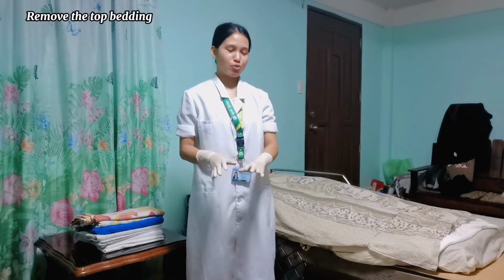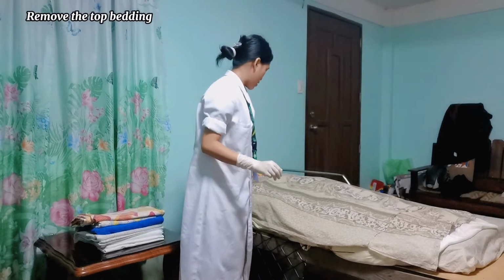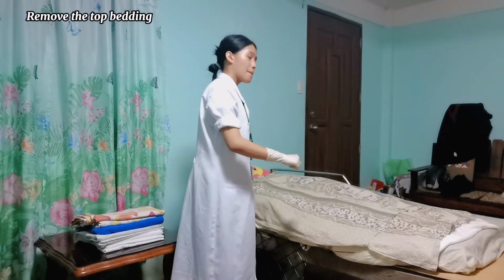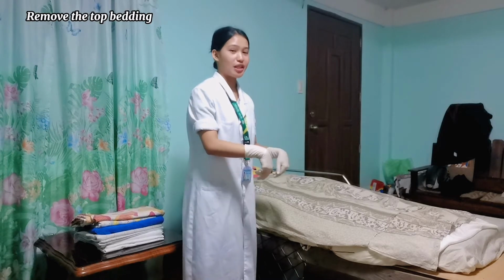And we will be removing the blanket that is covering the patient by folding or rolling it inwards.